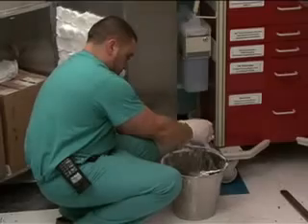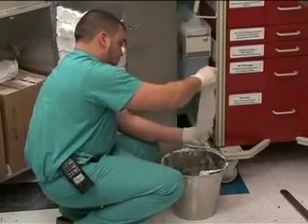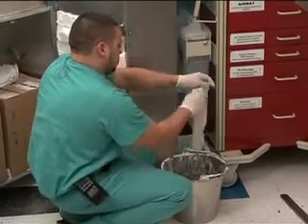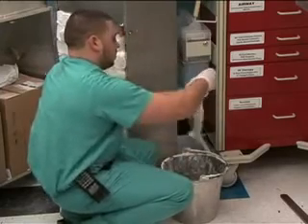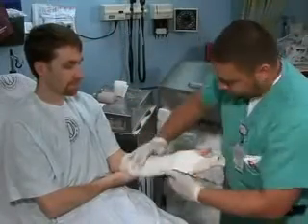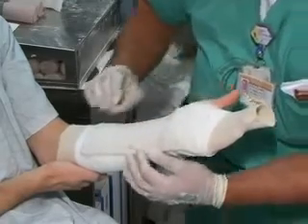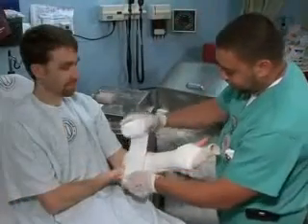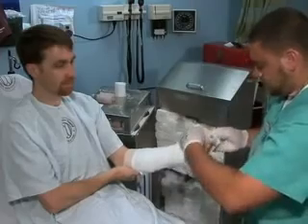Fill a bucket with lukewarm water less than 50 degrees Celsius and immerse the plaster material until saturated. Hold the wet plaster sheets vertically over the bucket and use two fingers to manually compress the layers in a downward motion. This removes wrinkles and excess water and will laminate the layers together. Place the plaster material over the cotton padding and smooth it to mold to the contours of the extremity in the appropriate anatomical position. Apply an additional layer of cotton padding to hold the splint in place and fold the ends of the stockinette back over the splint.